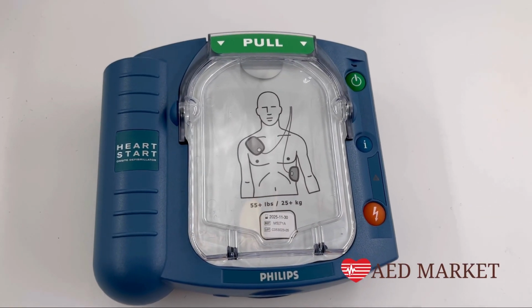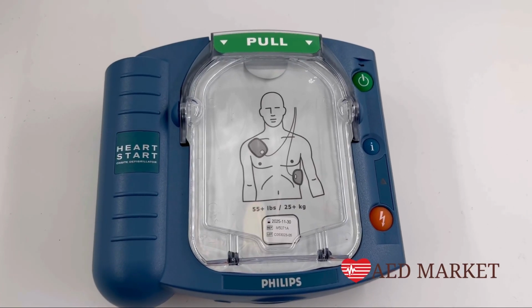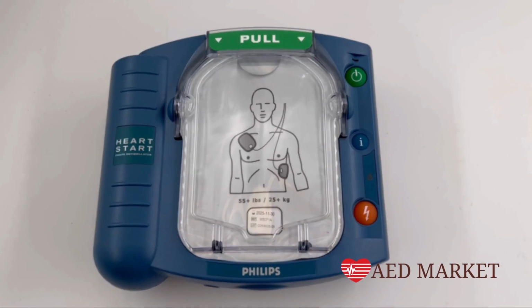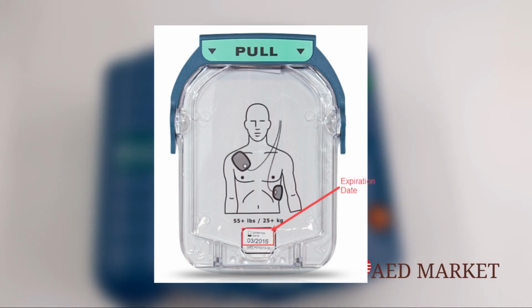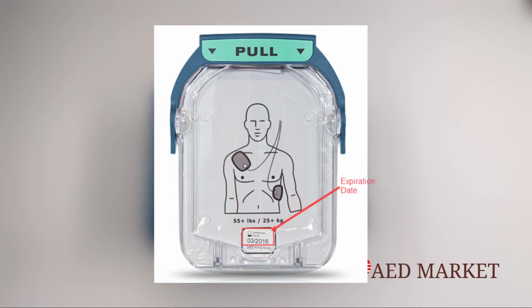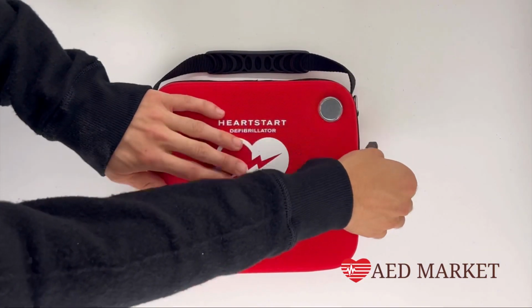To be ready for emergencies, it's important to keep the electrodes connected to the unit at all times. The pads have a 2-year expiration date visible on the outside towards the bottom through the clear cartridge window. You should change the pads at their expiration or after AED usage. To begin, remove the AED from the case.